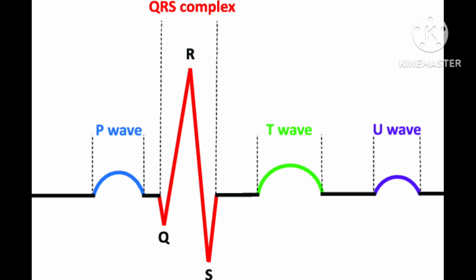Then what is its principle? That I am going to discuss. In this electrocardiography, there is a main role of electrodes. What are electrodes? An electrode is a metallic strip. It is made of steel, maybe in any shape, and it can allow passage of current. Means it has the capacity to lose electrons or gain electrons.